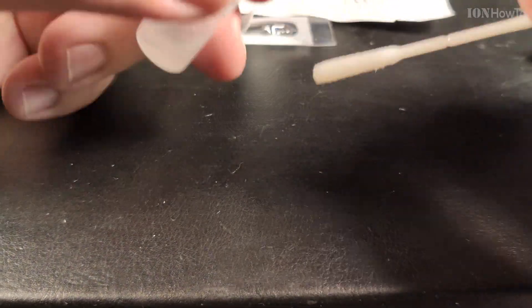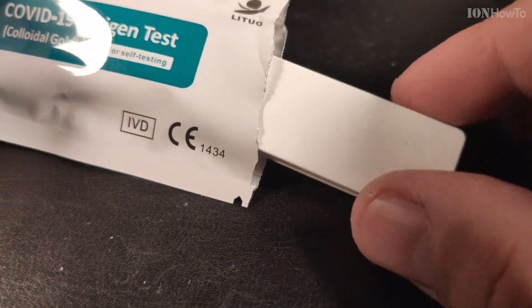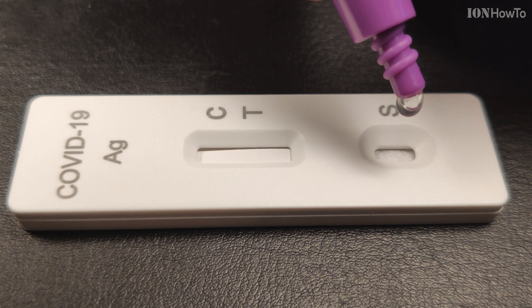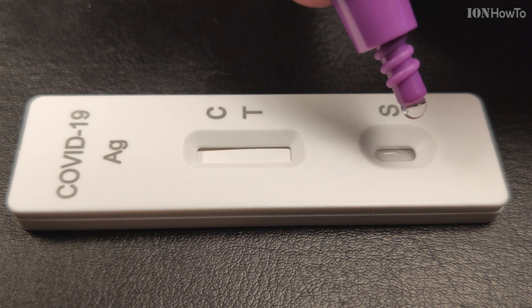The self-test is a way to do a quick test at home if you have any suspicion that you might be positive. Now I'm putting three to four drops after mixing the sample from the nose with the buffer solution.